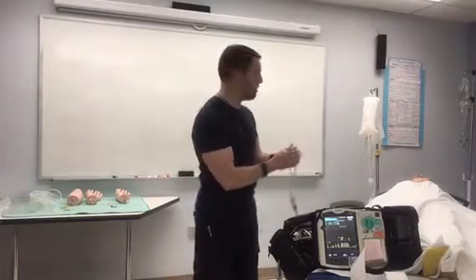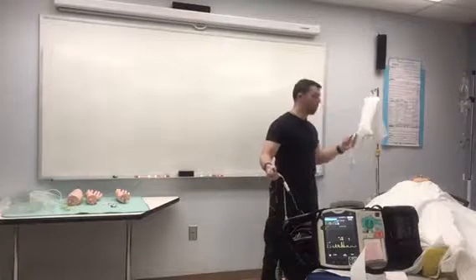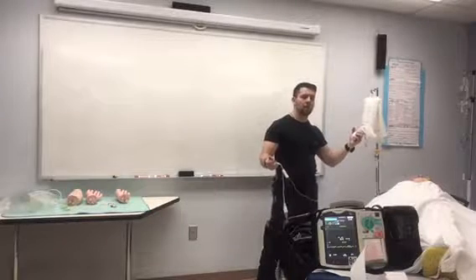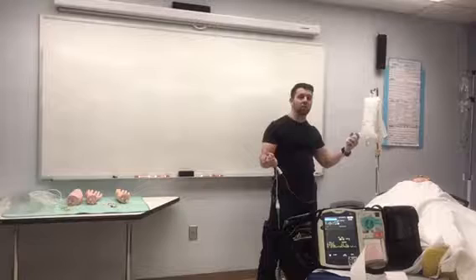As far as a hyper dynamic line, so an under-damping, not enough damping, the main culprit is going to be over-pressuring of your pressure bag, so you look and you're in the red. Okay? Now, without squeezing it, how could we suddenly become in the red? Well, the easiest answer for that is going to be in flight medicine.